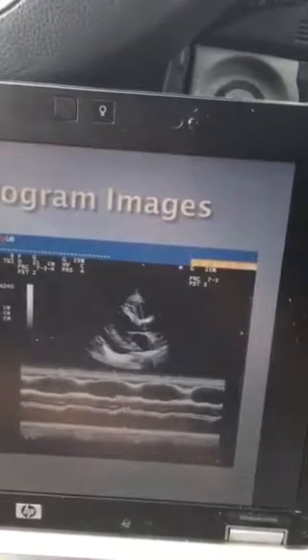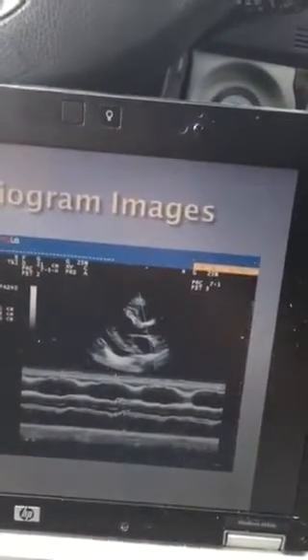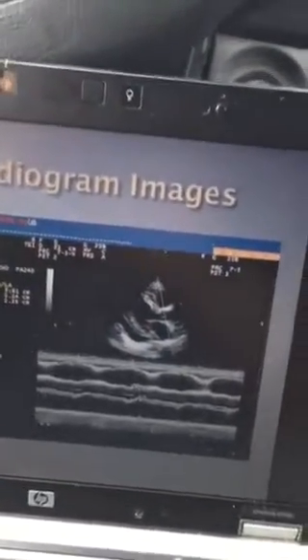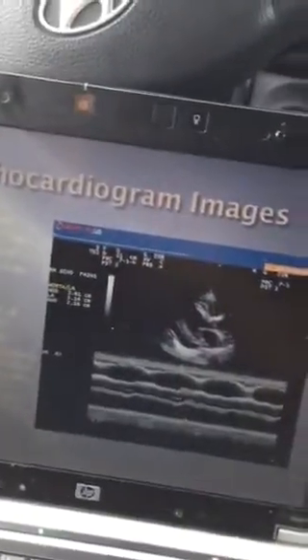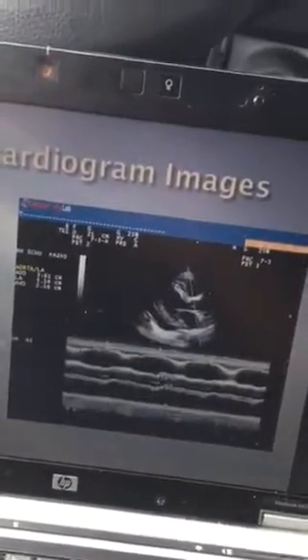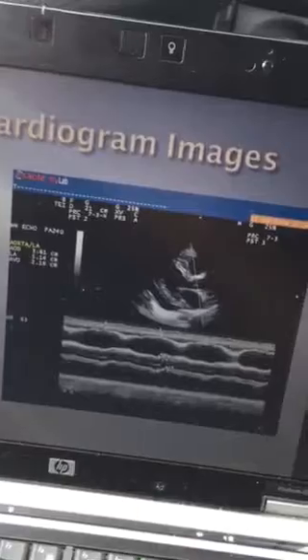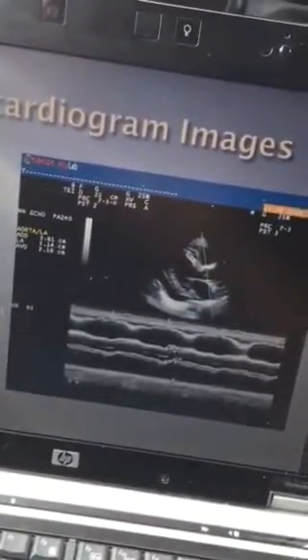And we can also see that we're at the upper limit of the aortic diameter. The aortic diameter is 2 to 3.7. This patient's aortic diastolic diameter was 3.6, so at the upper end of that value. Caliper placement on the aortic valve opening says 2.16. This measurement looked a little off to me, so I remeasured and I got 1.53, which is at the very lower limit for normal for the aortic valve opening.